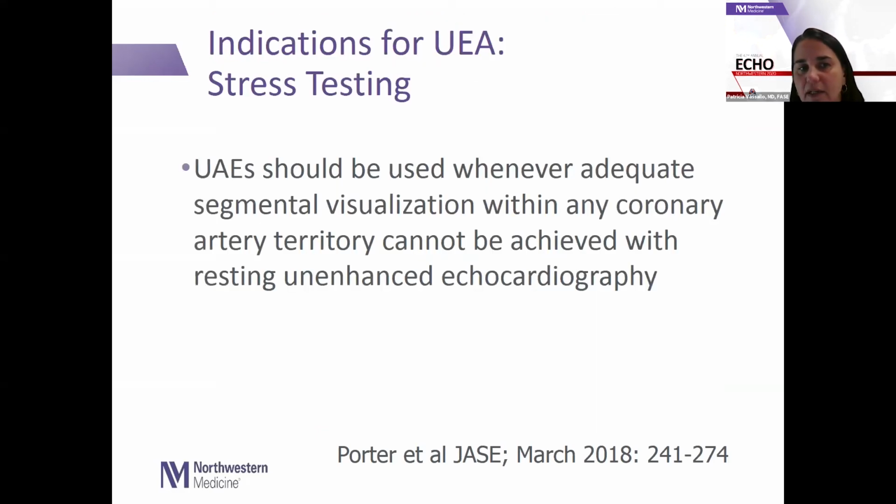And then another important indication for ultrasound enhancing agents is when you're evaluating regional wall motion abnormalities, both at rest and for stress testing. If you cannot evaluate the coronary artery distribution with 2 contiguous segments, then you need to use ultrasound enhancing agents. And this will help improve your diagnostic capabilities.